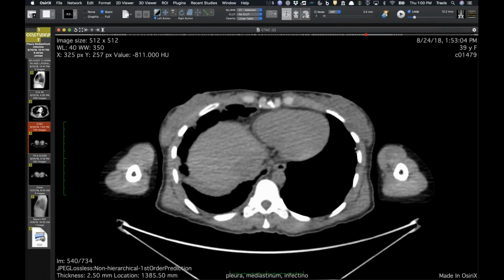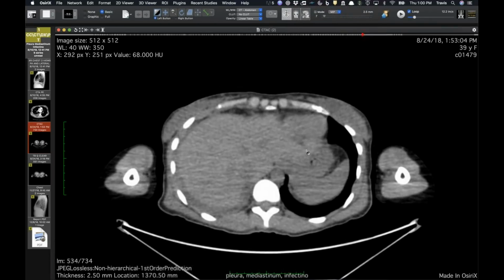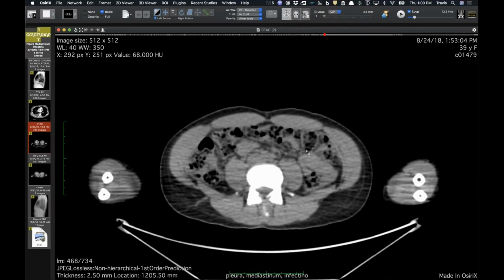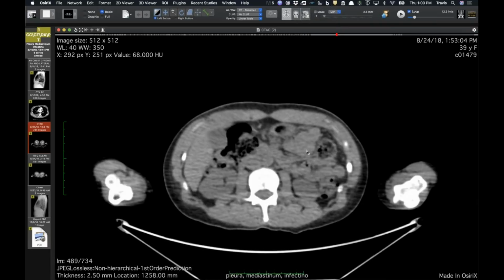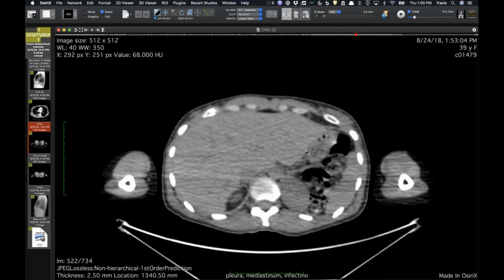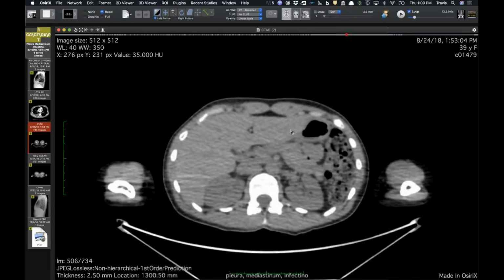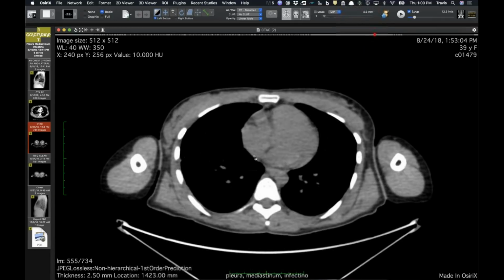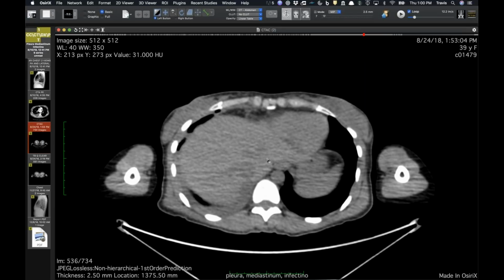And the upper abdomen looks okay, does it, Travis? Just curious. I think so, yeah. Yeah, on the PET. No peritoneal disease or anything. Wow, very interesting. Well, you've shown two really interesting cases of that kind of pleural thickening that always makes me nervous. And as it should make us nervous, right? But in this case, they eventually made the diagnosis.